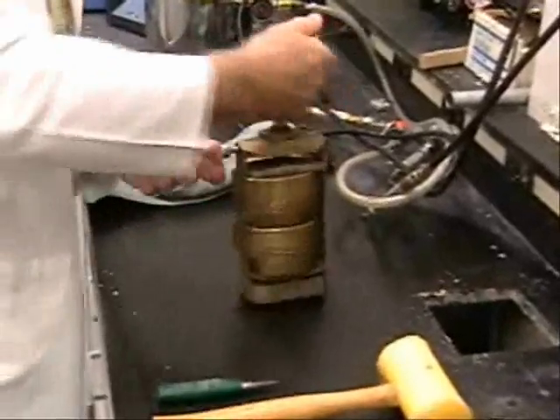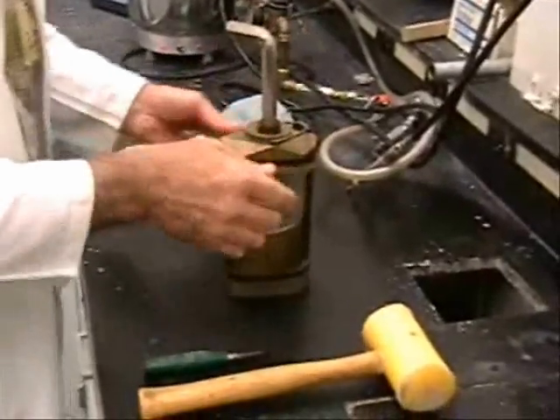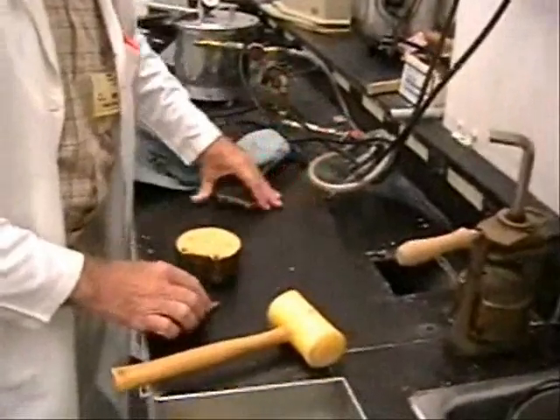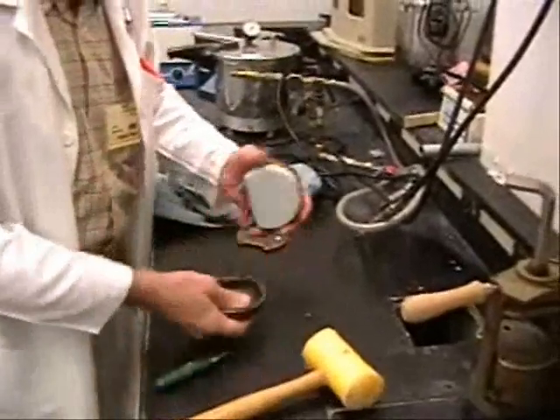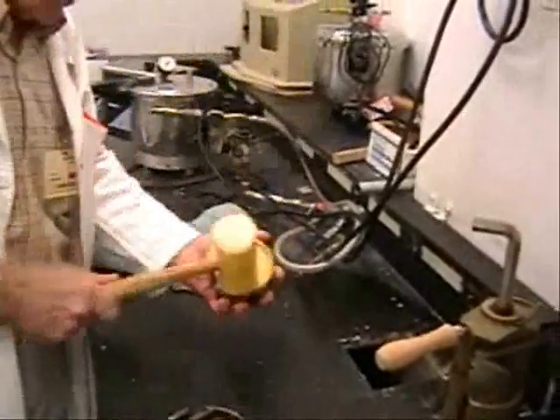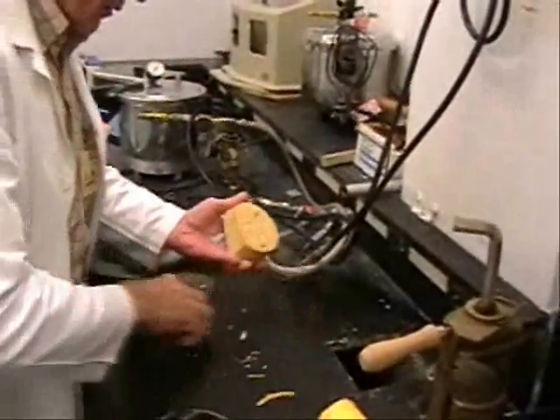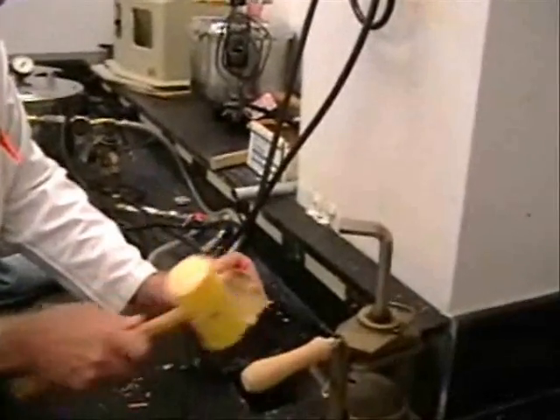The flasks are removed and allowed to cool to room temperature before the deflasking process begins. The stone mold is removed from the flask, and the processed denture is recovered from the mold with master cast still intact.